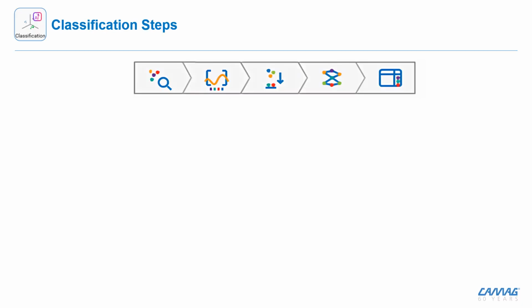The classification steps follow a logical left to right sequence, like the familiar evaluation workflow we have in the analysis files. There are 5 clear steps that lead to the results. In this slide, we will go briefly over these steps.